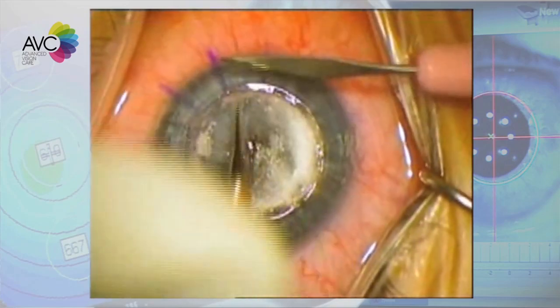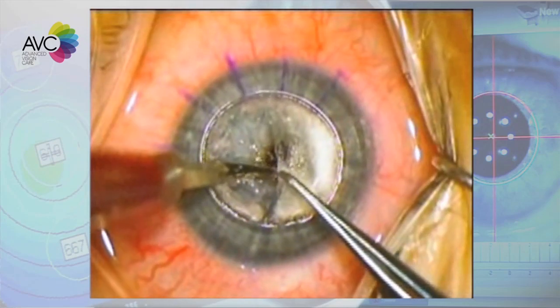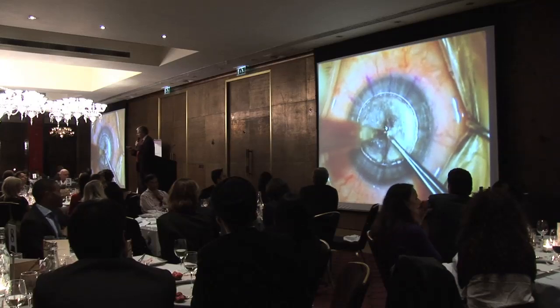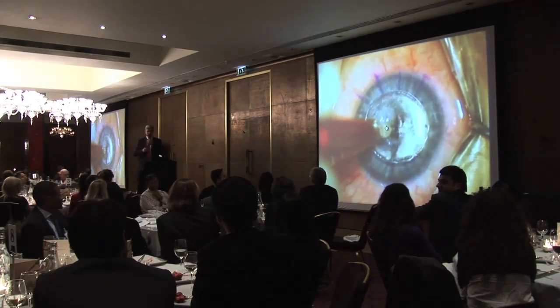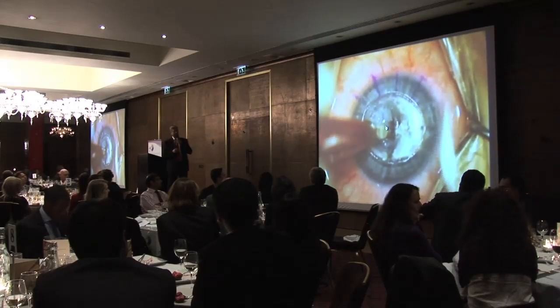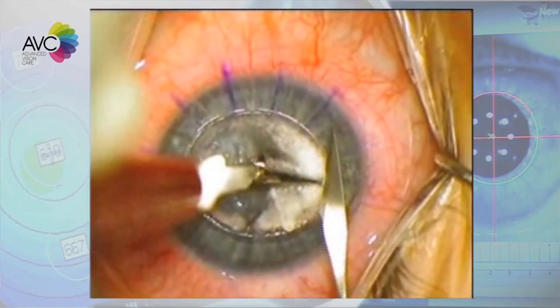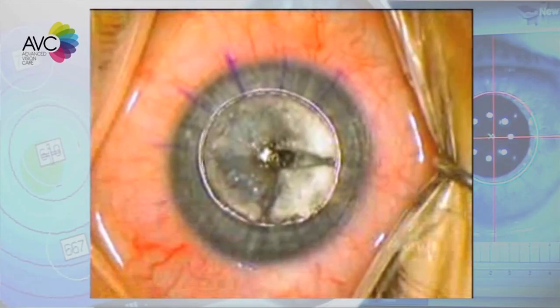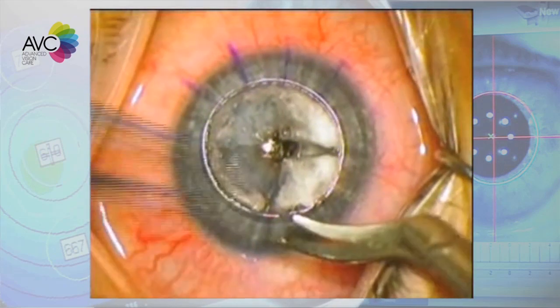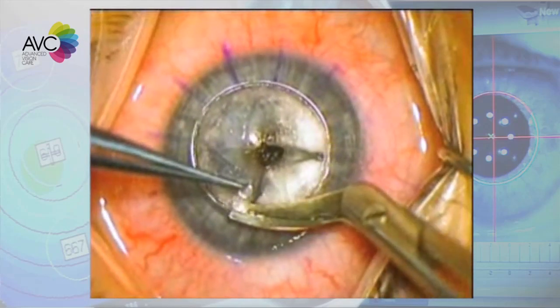The endothelium will be left behind, and we will then prepare the transplant, where the Descemet membrane and endothelium will be removed from the graft. So the graft will be transplanted without endothelium. Of course, we are trying to use now more subtle techniques with femtosecond laser. This is in progress.